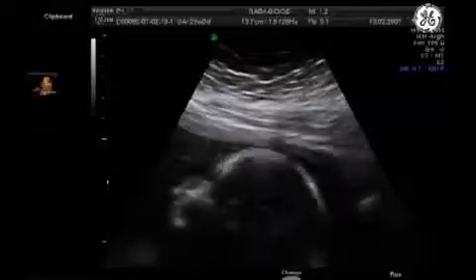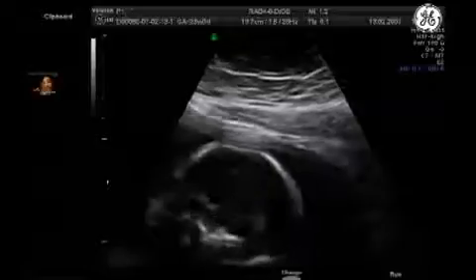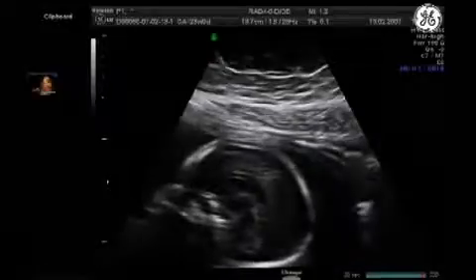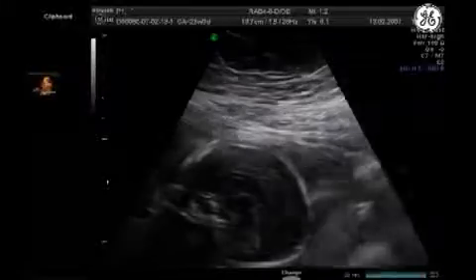And also, if the baby is not in correct position, you have to use your 2 hands. And also you can see here the corpus callosum with 2D, but you have to fight to obtain it with 2D because you have to move the baby.